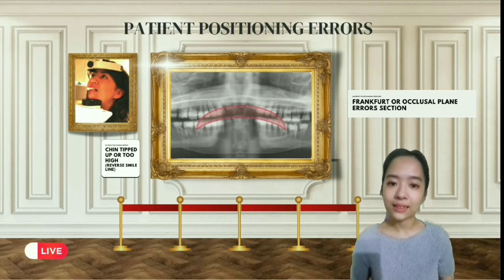reverse smile line. In this radiographic error, there are also several other evident manifestations, such as the condyles may not be visible or may appear near the lateral edge of the image. The hard palate and the floor of the nasal cavity appear superimposed over the roots of the maxillary teeth. The maxillary incisors appear blurred and magnified, by which a loss of detail occurs in the maxillary incisor region.